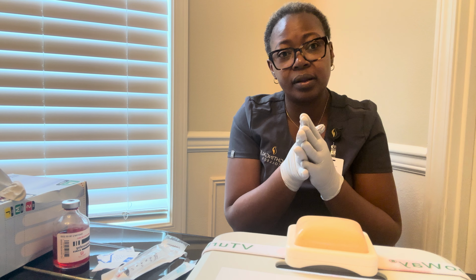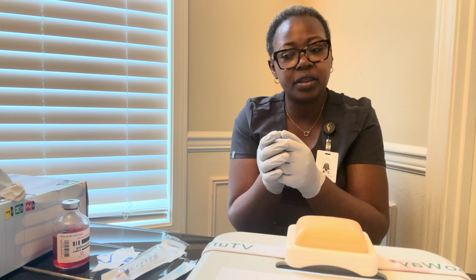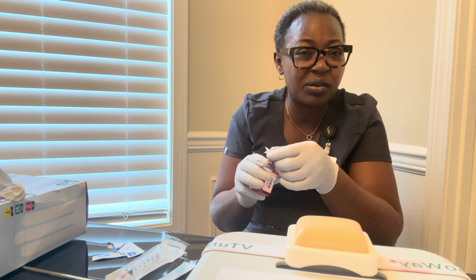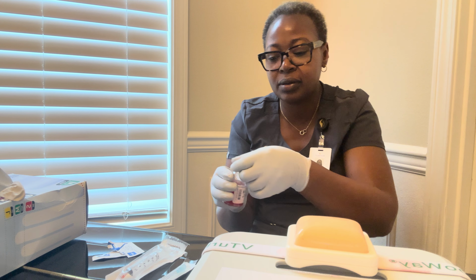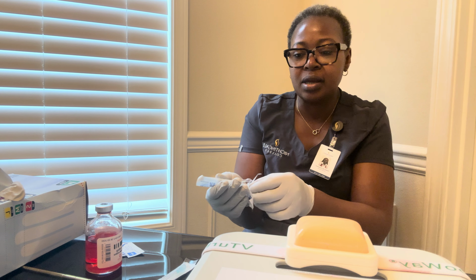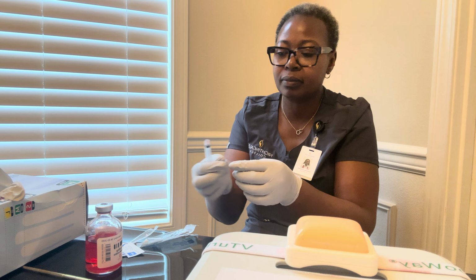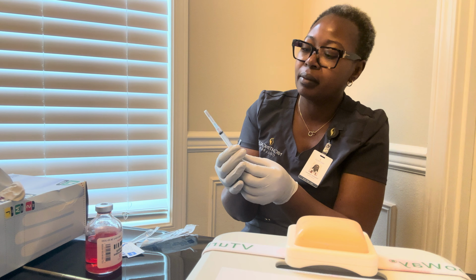So I will then go ahead and, before I inject, I will clean the top of the medication vial. I will clean for 15 seconds, not to introduce germs or any bacteria on the medication. Then I'll go ahead and instill 1.5 ml of air in my syringe. Let me prepare this. I'll instill 1.5 ml of air.